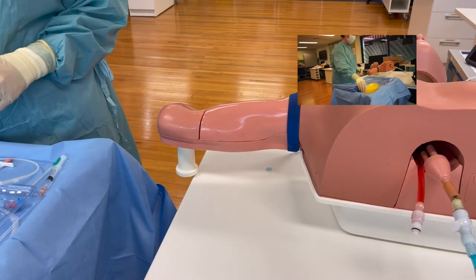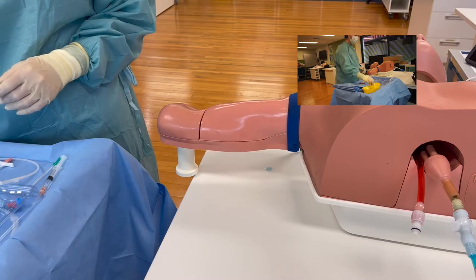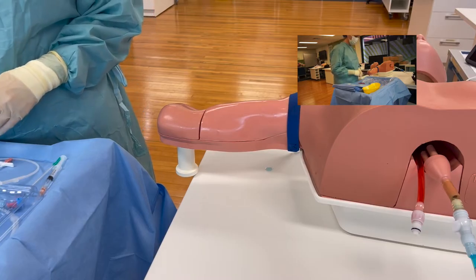I'm going to now use my kidney dish as my sharps bin, so I can pop my blunt drawing up needle in that.